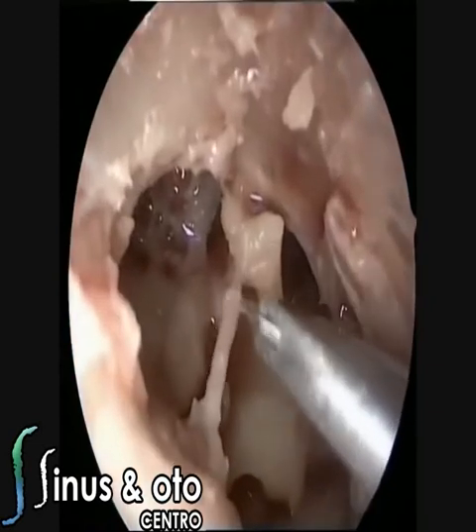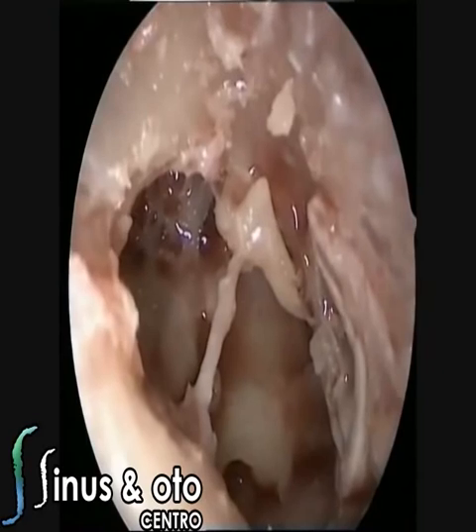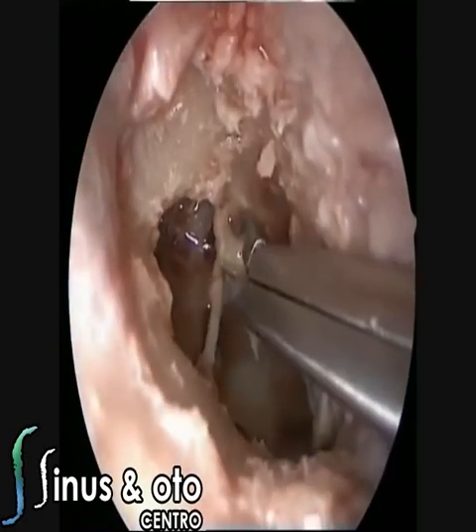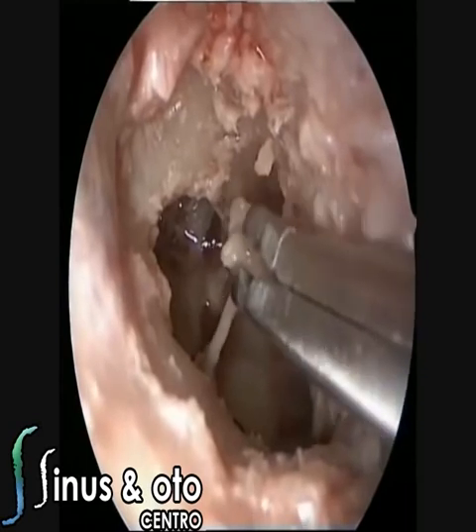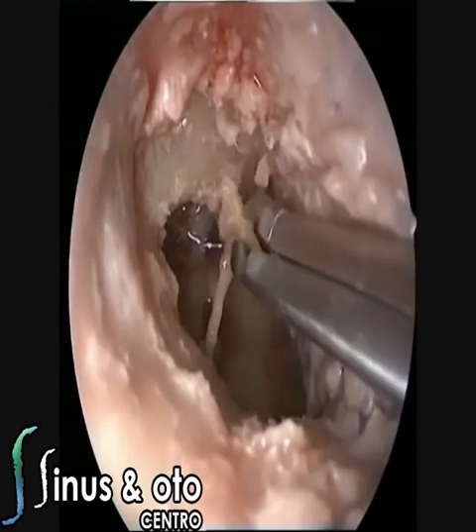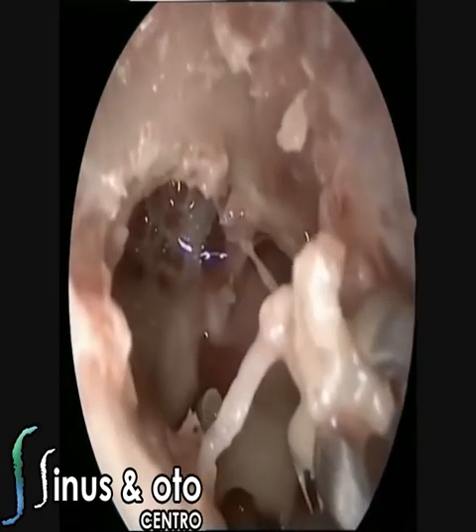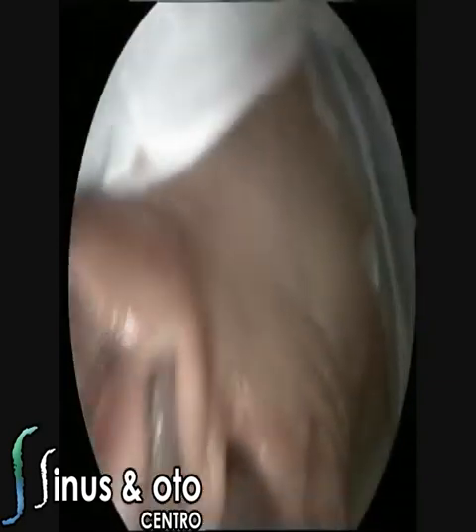The mucosa of the middle ear and the mucosa of the mastoid are very important, both in ventilation, gas exchange roles, and also the immunological components that they have. So when you drill the bone and destroy this mucosa in some cases where you didn't need to drill, or you would drill just for access of the middle ear, you can have problems in the future because you are destroying, in most of the cases that you drill, normal mucosa.